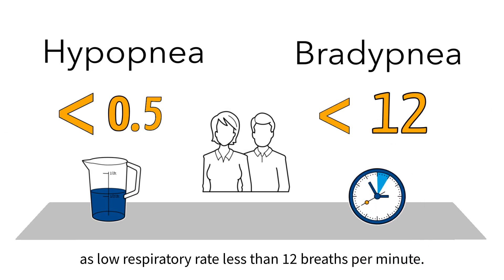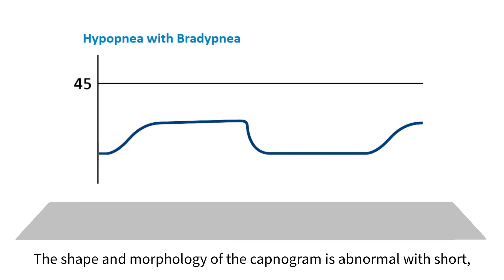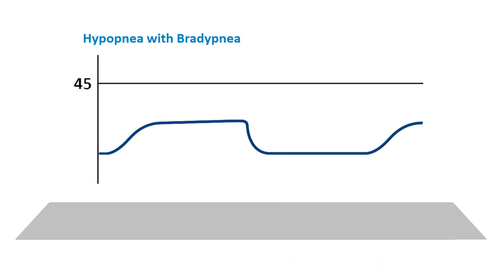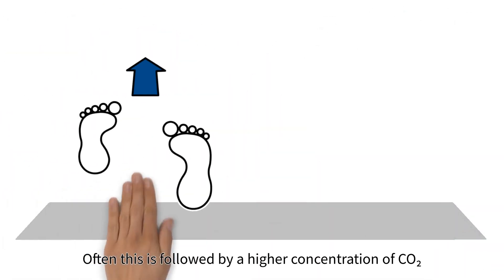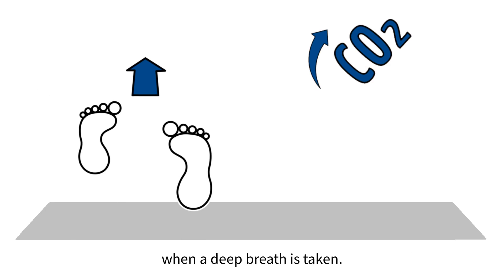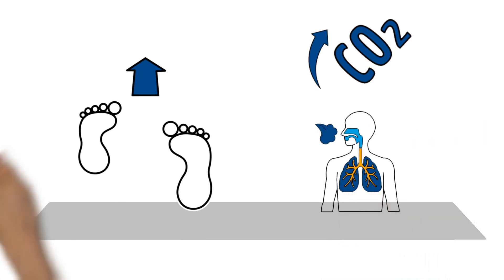Bradypnea is defined as less than 12 breaths per minute. The shape and morphology of the capnogram is abnormal, with a short, non-plateauing waveform and slow respiratory rate. Often this is followed by a higher concentration of CO2 when a deep breath is taken.